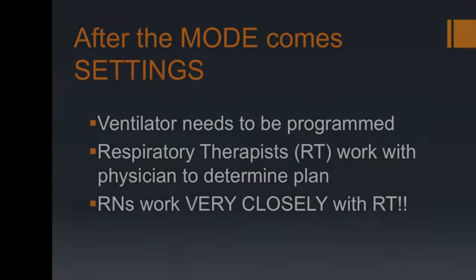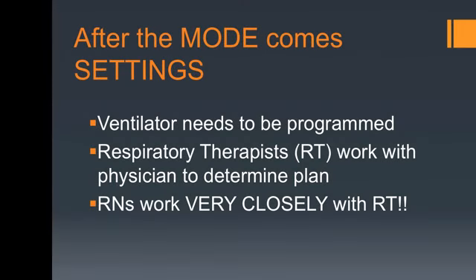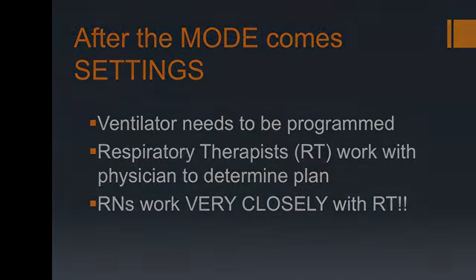So once we get through all of these modes that we discussed, now we need to talk about the settings that are applied. The ventilator needs to be programmed, of course. Respiratory therapists work with the physician to determine the plan. RNs do work very closely with respiratory therapy, but the RNs do not determine the settings on the machinery. There may be algorithms that are in place in intensive care settings, but typically it's respiratory therapy and the physicians, and the nurse's role is separate.